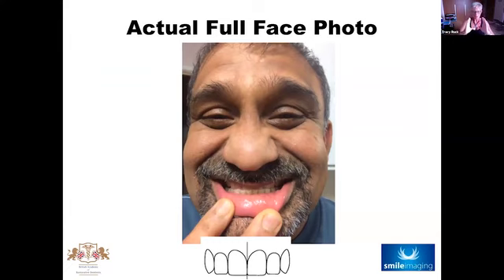So again, it's not a great angle. It's making the gentleman's nose look a bit big, and because he's pulling his lips down. I mean, none of us look that attractive like that, yes? So we want to think about the golden proportions, how the lips are naturally falling around the teeth, not, you know, having them pulled around. So before we image the case.